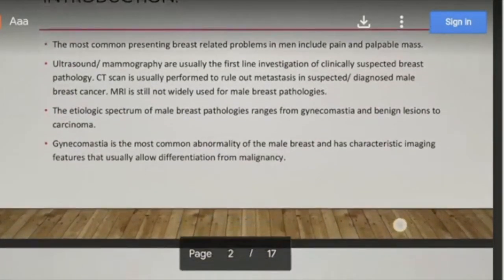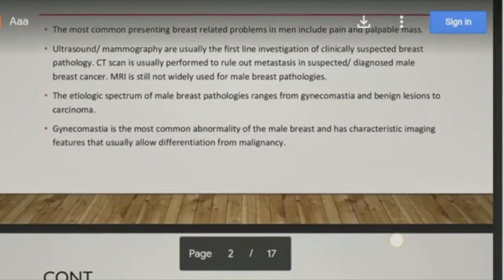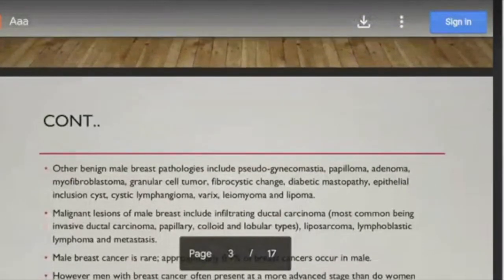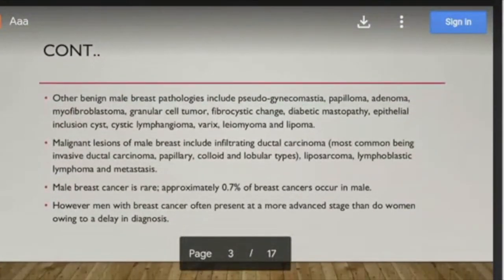The etiologic spectrum of male breast pathologies includes gynecomastia, pseudo-gynecomastia, papilloma, adenoma, myofibroblastoma, granular cell tumor, fibrocystic change, diabetic mastopathy, epithelial inclusion cyst, lymphangioma, varix, leiomyoma, and lipoma.